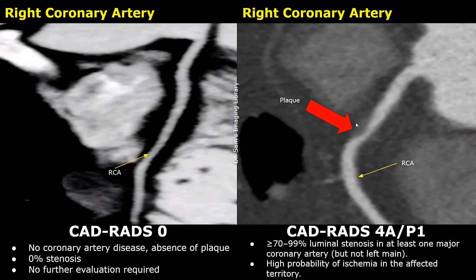Almost the entire lumen is narrowed, but a small portion is open, and the enhancement distal to the stenosis is normal.